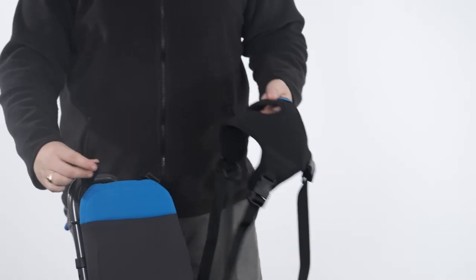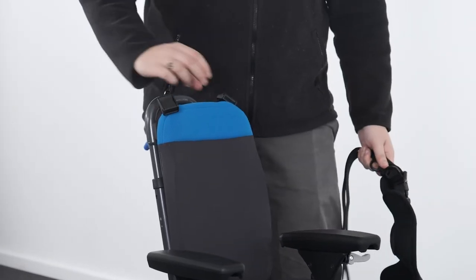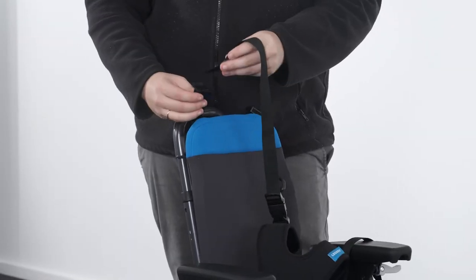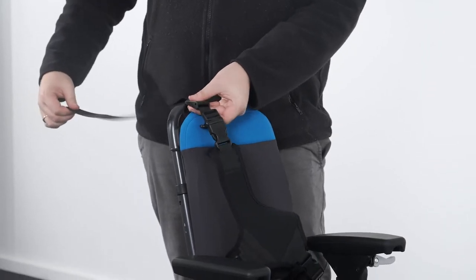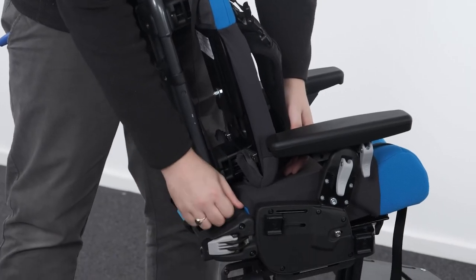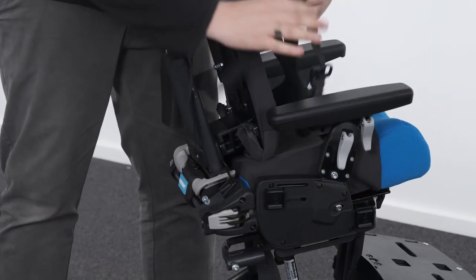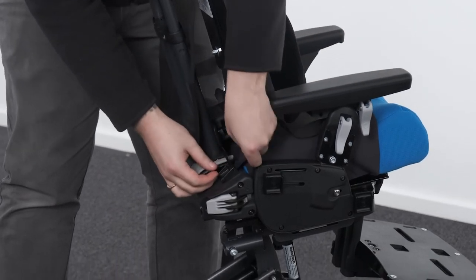Attaching the butterfly harness. To attach the butterfly harness, first locate the cam buckles at the top rear area of the backrests. Pass the webbing through the cam buckle and secure in place by clamping down. The bottom connection points are on the back of the seat base. Pass the webbing through the cam buckle at the back of the seat core and secure in place by clamping down.